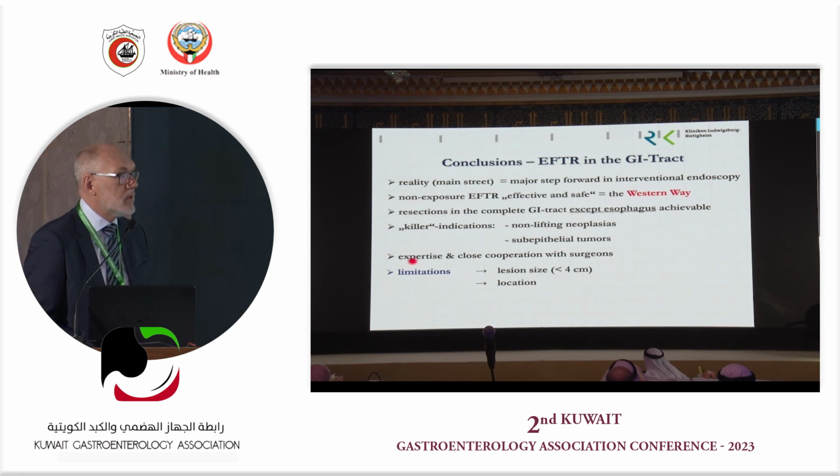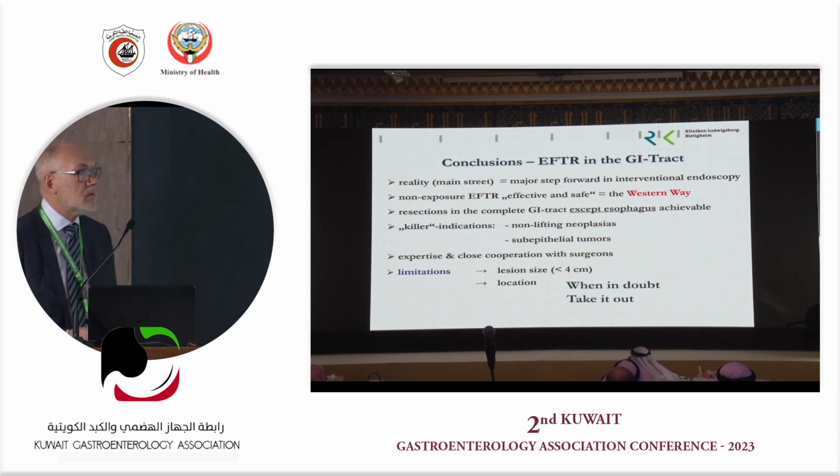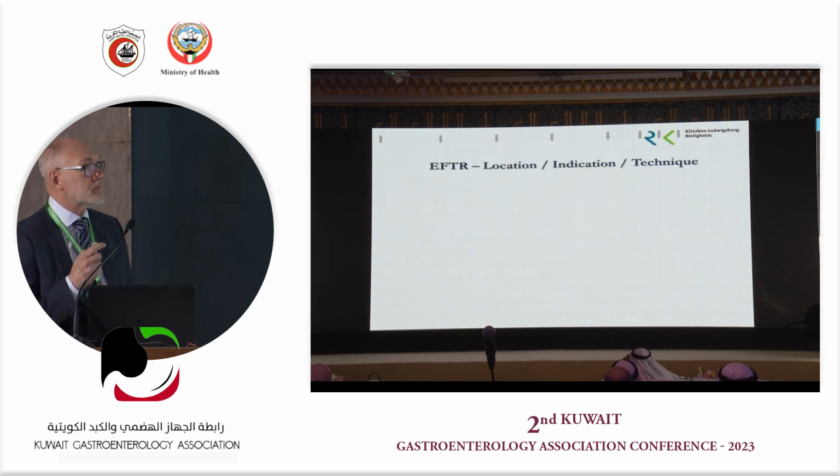Of course, you need expertise and close cooperation with your surgeons, and the limitation is the size and the location of the tumor. So when in doubt, take it out, but take it out endoscopically. So EFTR is about location, indication, and technique.